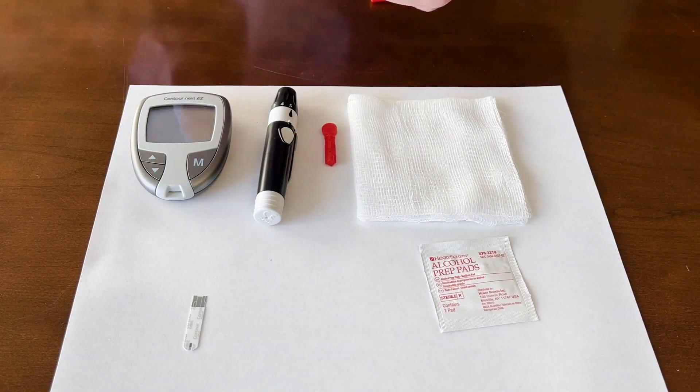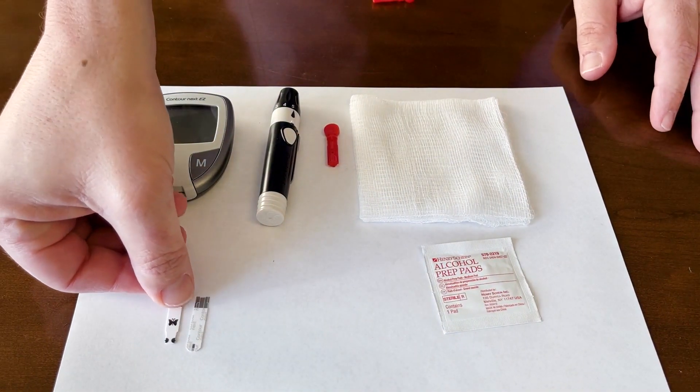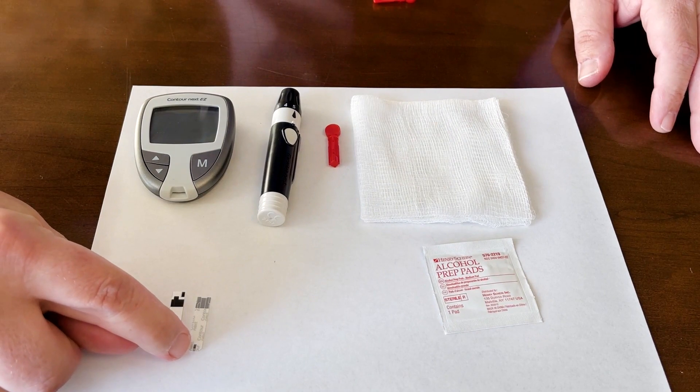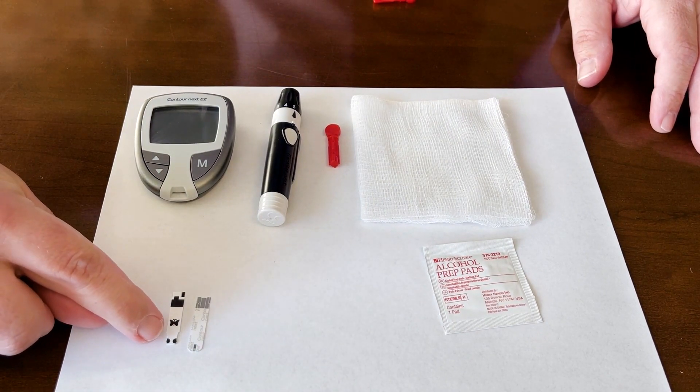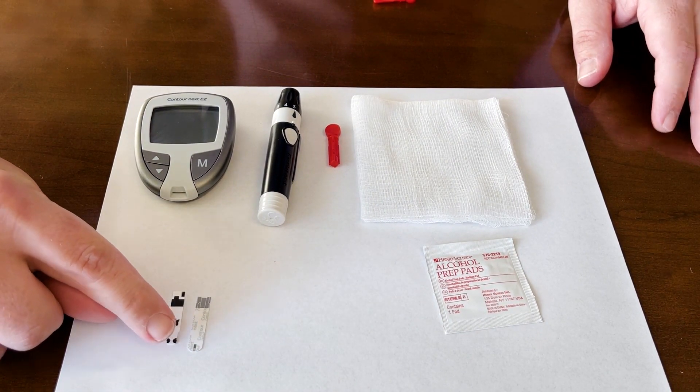First I like to talk about strips. There's different kinds of strips. I've got two here, some where you put the blood at the very end, and then like this strip here, you can put it onto the sides.